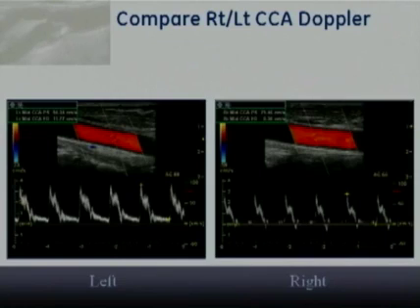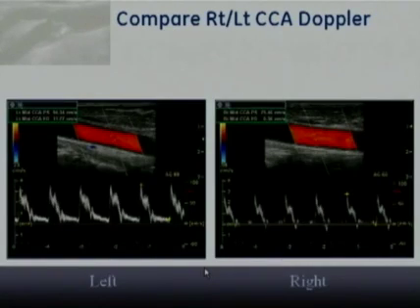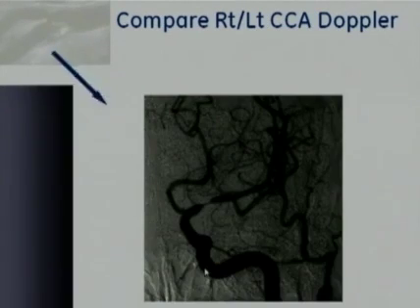Now, that could be an ICA occlusion, which is probably the most likely event, but it could also be that there is a stenosis that's intracranial, and the most likely location intracranial would be at the carotid siphon level. And in this particular case, it was just beyond the siphon, and we have this high-grade stenosis within the middle cerebral artery. Now, we won't see changes down at the common carotid from an intracranial stenosis unless the stenosis is at least 70% diameter reduced. And of course, this is much more than that.